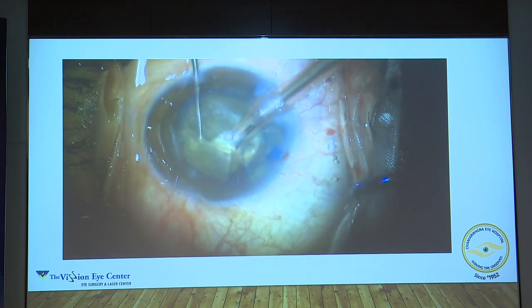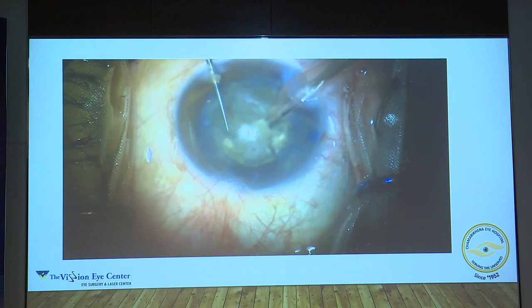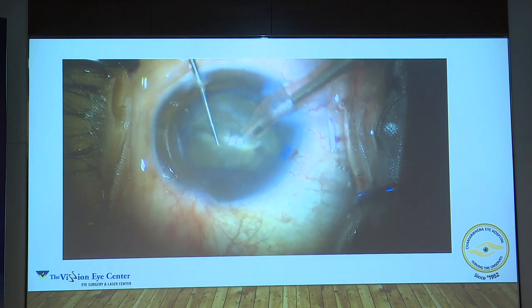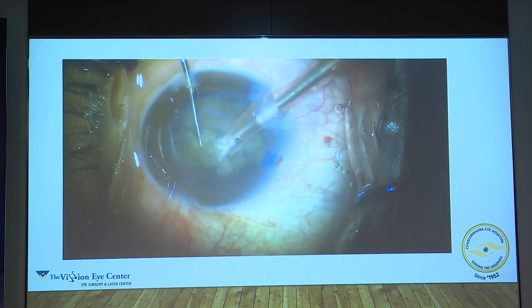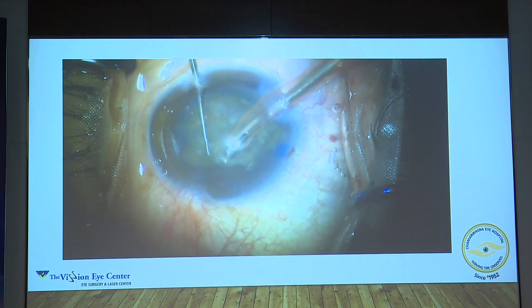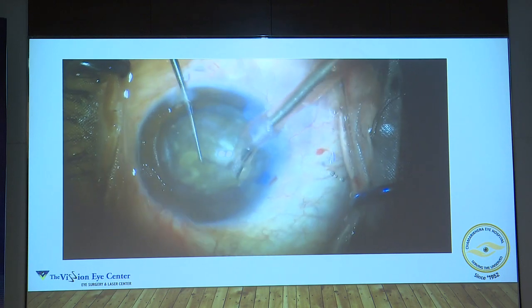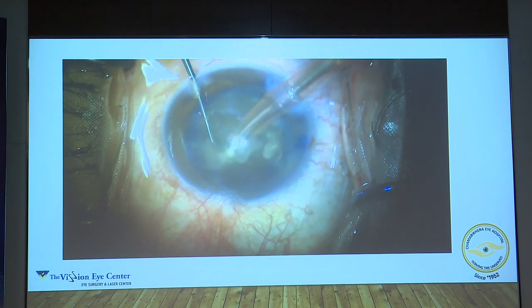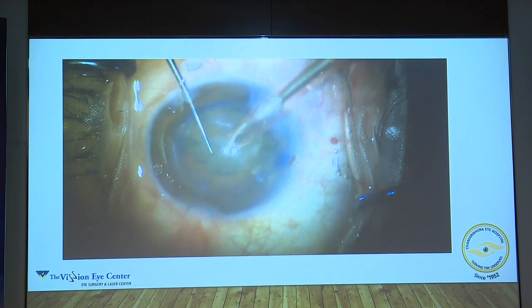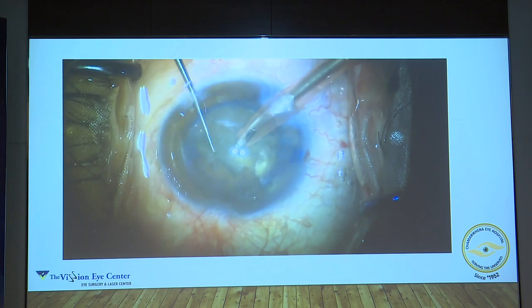The alternate technique is a flower petal technique, wherein you keep cracking the periphery and take the central guttli of the nucleus and eat that first. Once that central part is out, the periphery becomes easier. But that technique needs a lot of experience. As a beginner, you must try and crack the central part of the nucleus — once that is done, the rest becomes easier. There is no set rule that you have to make only four quadrants; you can make six or eight, depending on how hard the nucleus is.